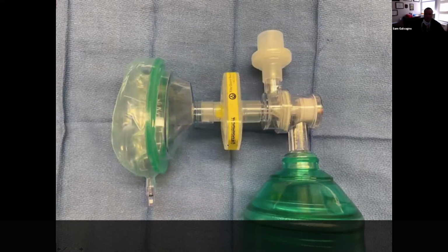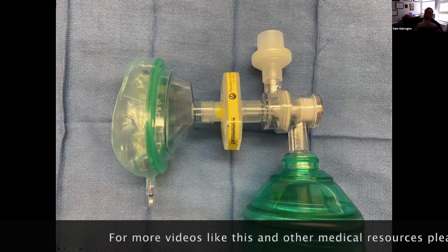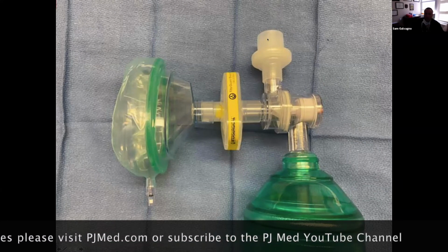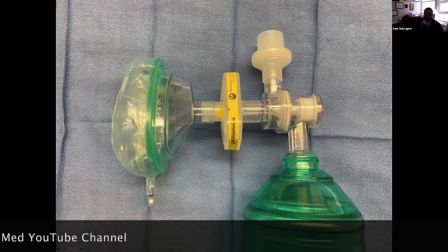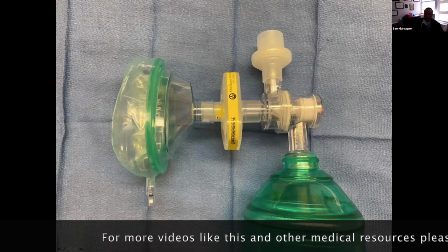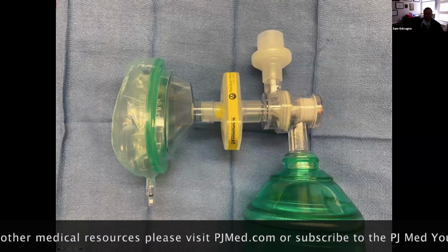So important to get this filter on your bag. I know you guys wanted a couple pictures. This is one form of a viral filter. These are pretty good, by the way. They're not perfect, but when the patient breathes back, it's going to go right out here, right? If you don't have this protective filter on, this really does take the viral particles out of the game. Most of them, up to 99% of them, okay? So you've got to make sure you get this on, and then when you get them on the vent, you've got to also hook this up to the vent. I'll show you that in a minute.